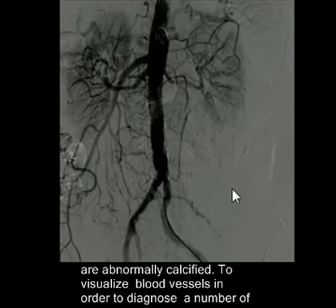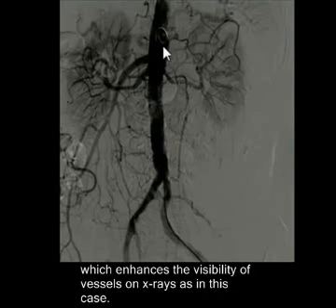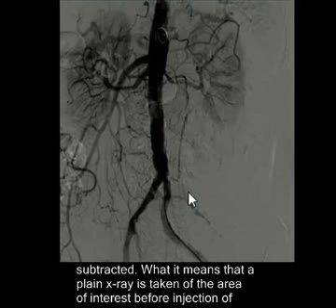To visualize blood vessels in order to diagnose a number of conditions or for treatment, you'll have to use an intravascular contrast medium which enhances the visibility of vessels on X-rays, as in this case. To improve the diagnostic quality of such procedures, images nowadays are digitally subtracted.